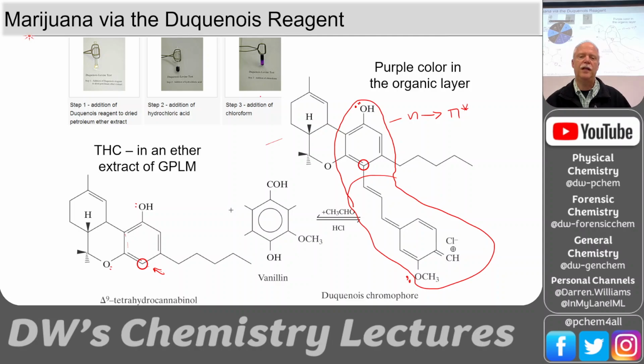So this is THC. If it was THCA, in other words, the acid, then this piece right here has been turned into an acid group. And again, it's going to be a very different color because you've got a different pi cloud and different energy levels, and it doesn't take much to shift those peaks in the visible range. What is that?